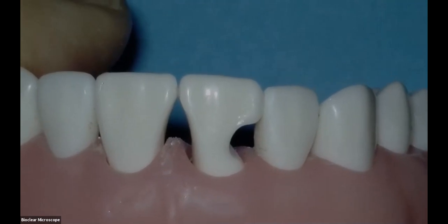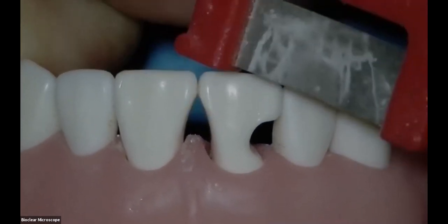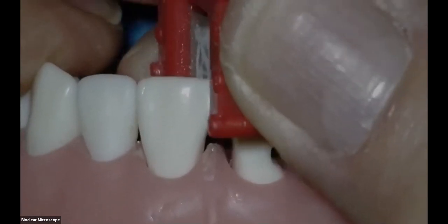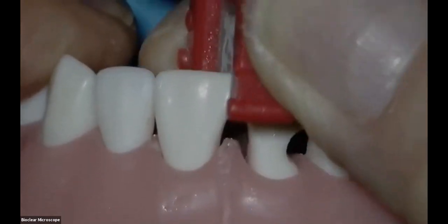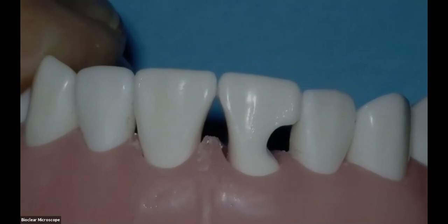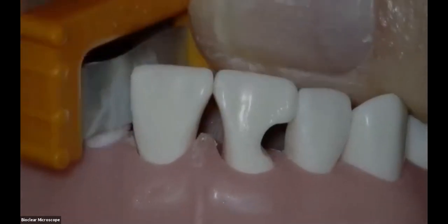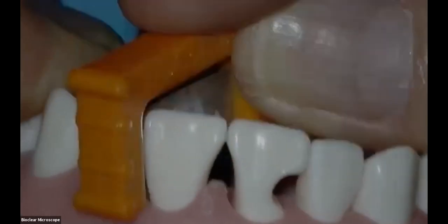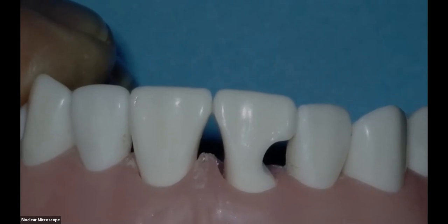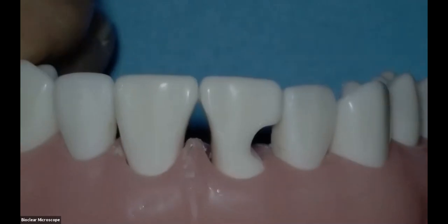So we're not going to open the contact. We're just going to sand the contact lightly. Now I'm going to take the last in the red true contact sander. It's double-sided, and that allows me to have a contact that's just lightened. It broadens the contact and allows the matrix to slide all the way to the bottom of the sulcus. Okay. So before my rubber dam goes on, I'm now going to measure with the black triangle gauge.